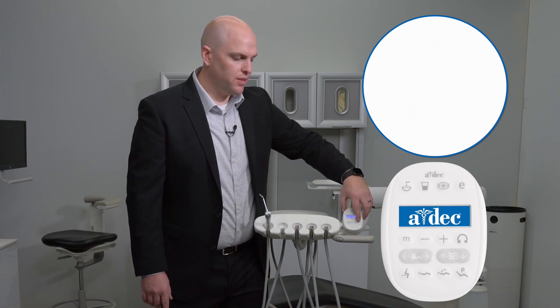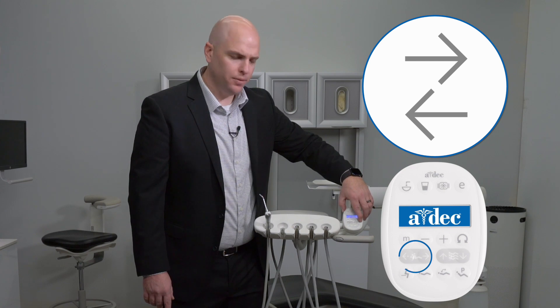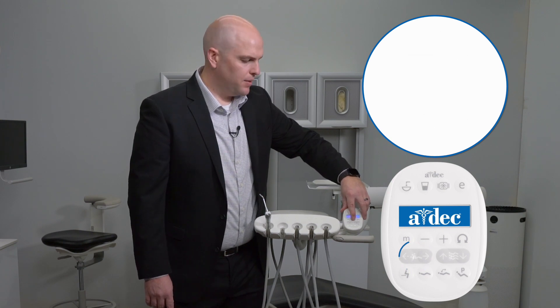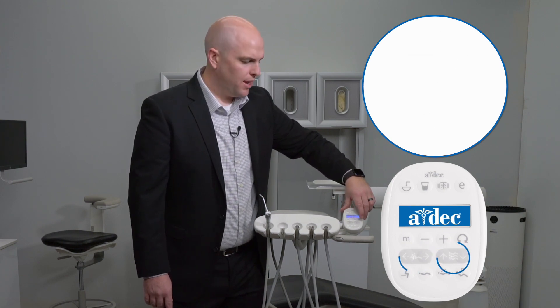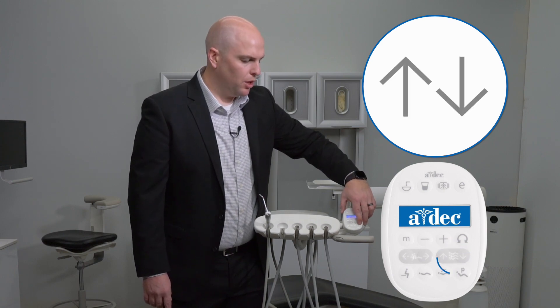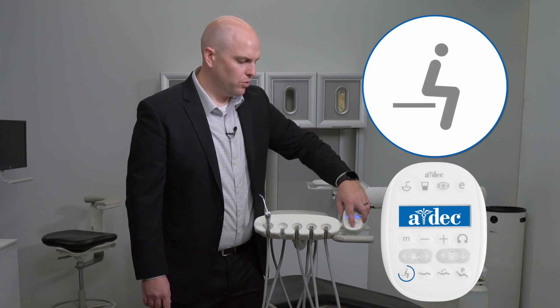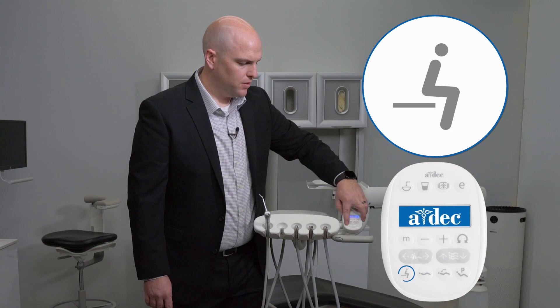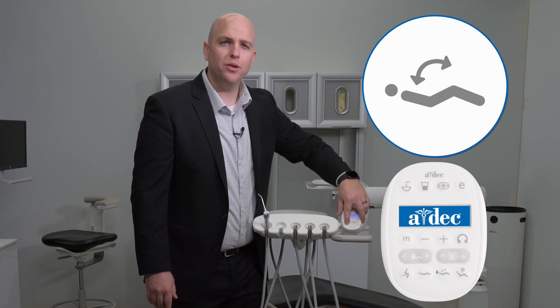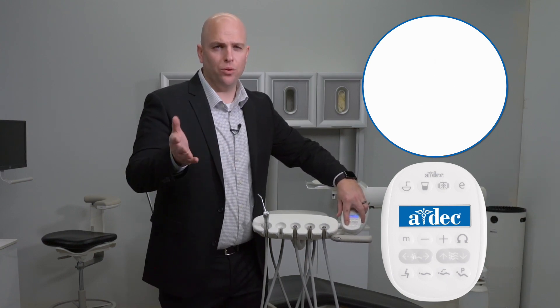Below those buttons, you'll see the arrows to manually adjust the chair. On the left-hand side, the button to the left moves the chair backwards, the next button moves the chair forwards, and then chair movements up and down. Below that, you have your chair presets — from left to right: your entry/exit position, your operating position, and then your x-ray position. These settings come factory preset; however, you can adjust them to fit your needs.